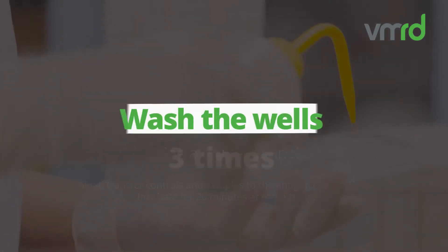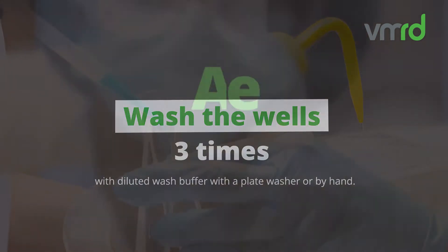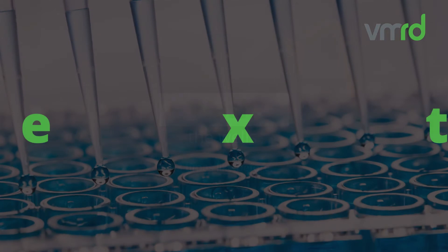Wash the wells three times with diluted wash buffer using a plate washer or by hand. Add the diluted conjugate to the wells and incubate for 20 minutes at room temperature. Wash the wells three times like before.